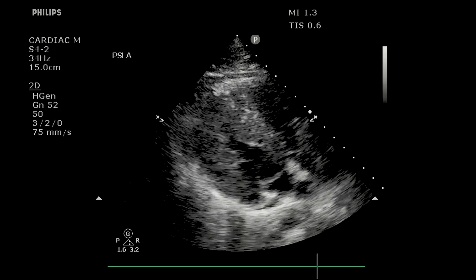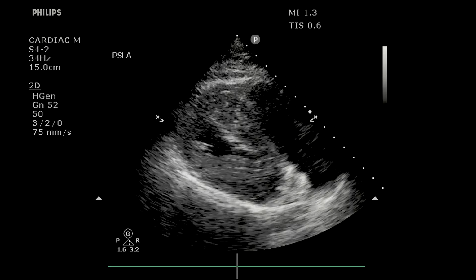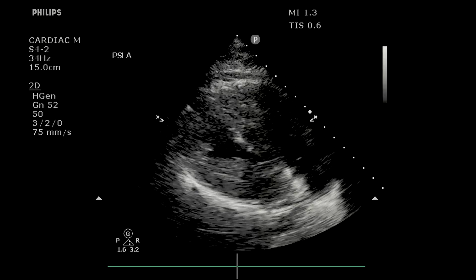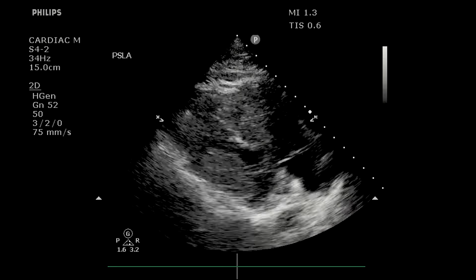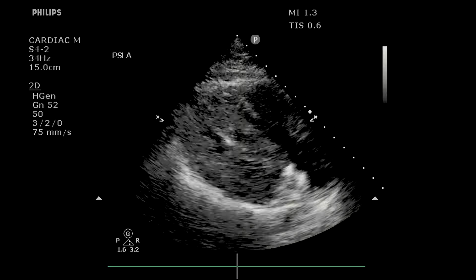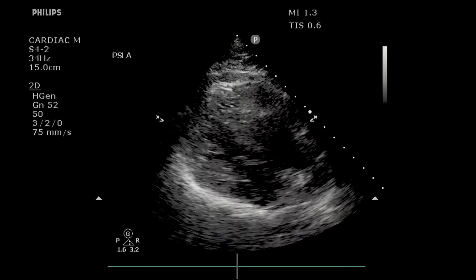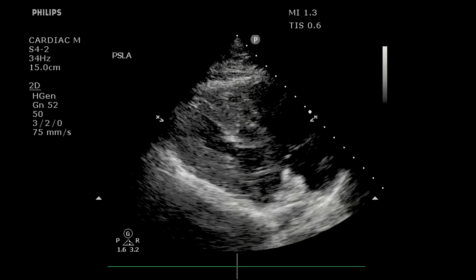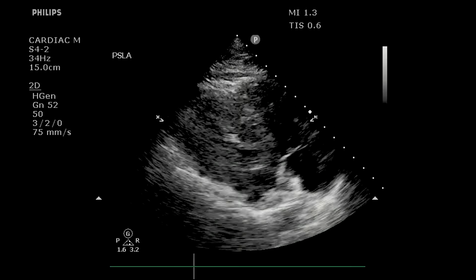So you have to look clinically at what the patient's doing, right? What is the broad picture looking like as you're assessing this? Because this isn't going to rule in or out heart failure if the patient's super duper hypovolemic. And so what's the IVC look like? Is there anything in the pericardium? What is the myocardial wall doing essentially, right?